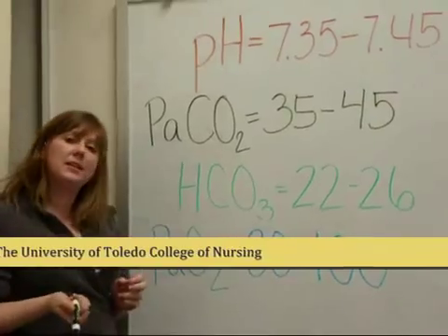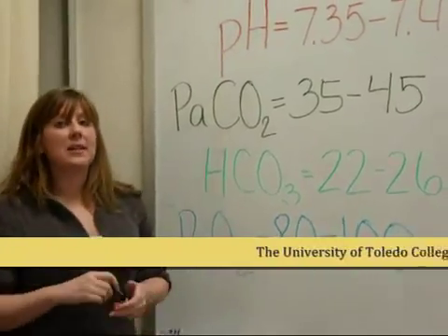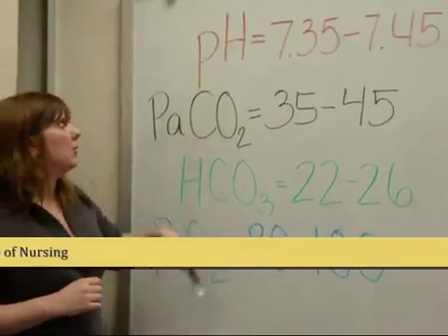We're getting ready to graduate this spring, and we're going to talk to you today about how to read arterial blood gases, otherwise known as ABGs. So, a little trick that we did to help with color code, and as I'm going through the numbers, I'll teach you why we did that.